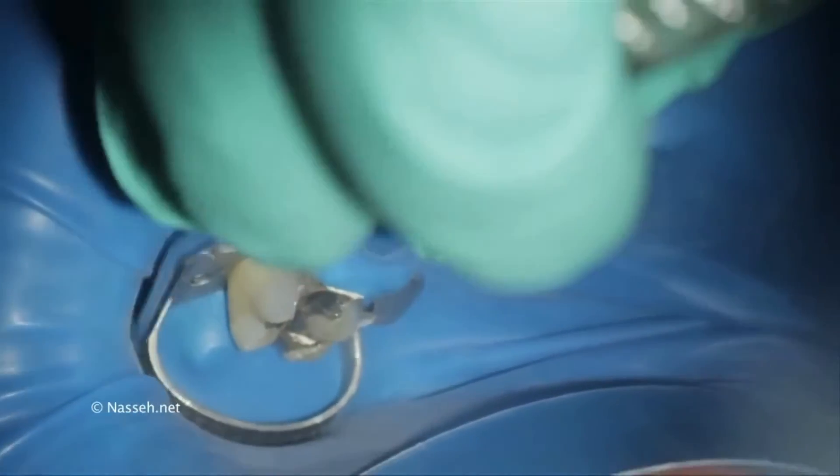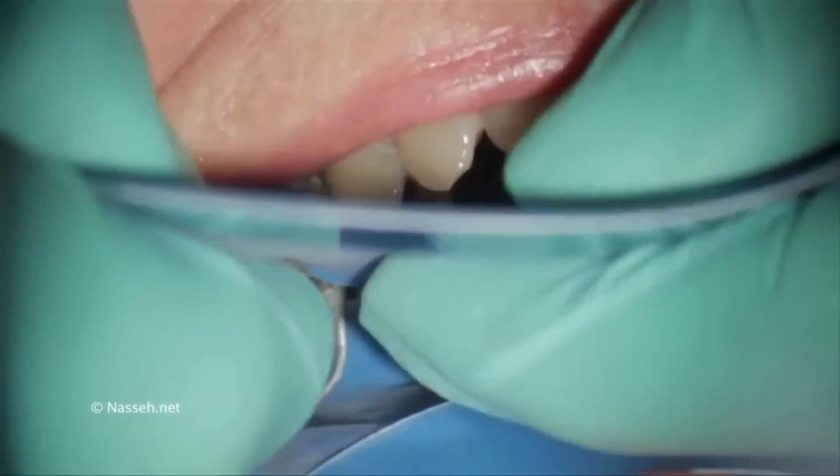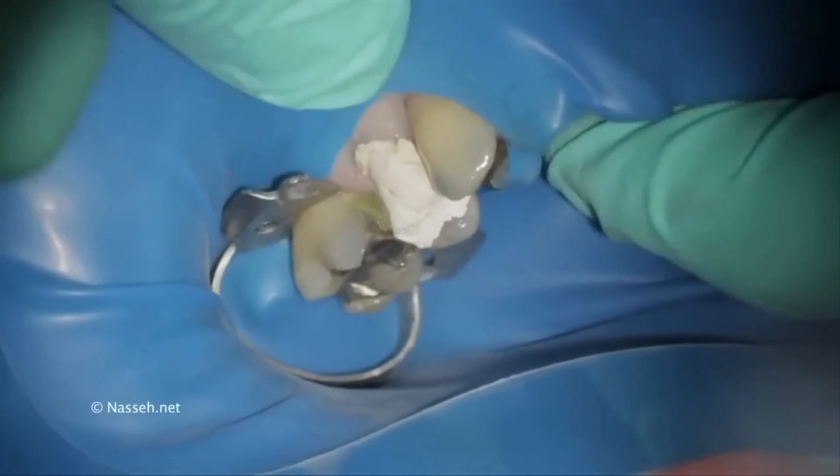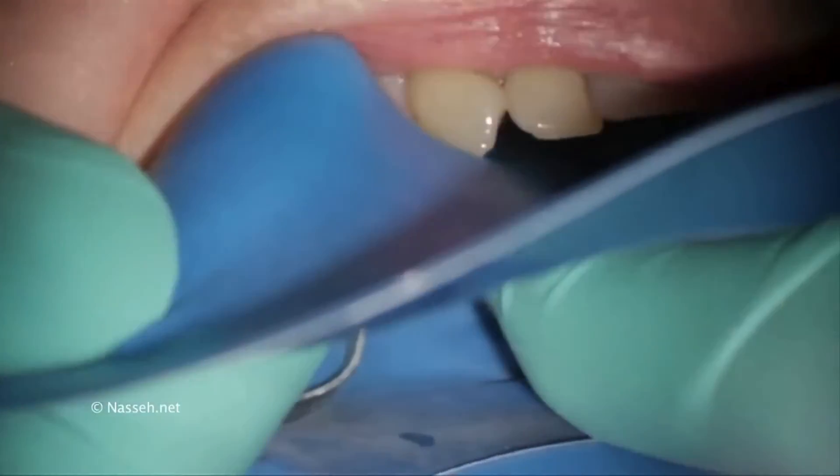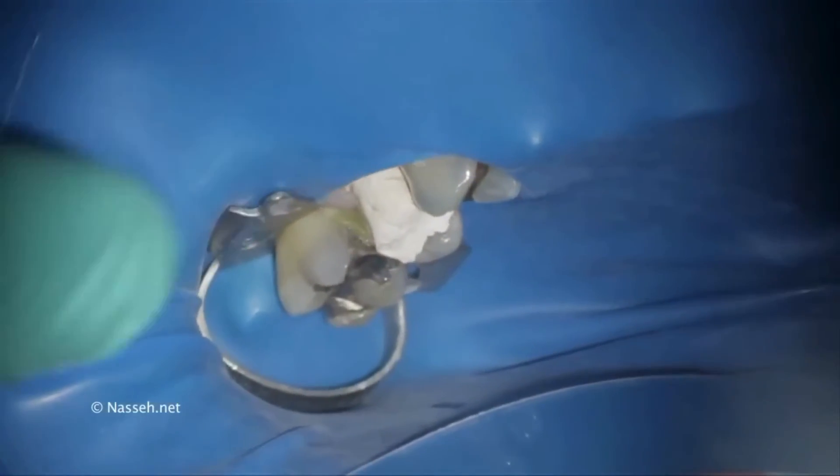With the split dam technique, the tooth distal to the tooth in question is clamped and the rubber dam is pulled over that tooth and the tooth in front of it. Here I'm using Heuwfredi's clamp 13A to isolate tooth number three, then pulling the rubber dam over tooth number four, which is going to be treated. The rubber dam is then pulled through the mesial area of tooth number five to secure it.